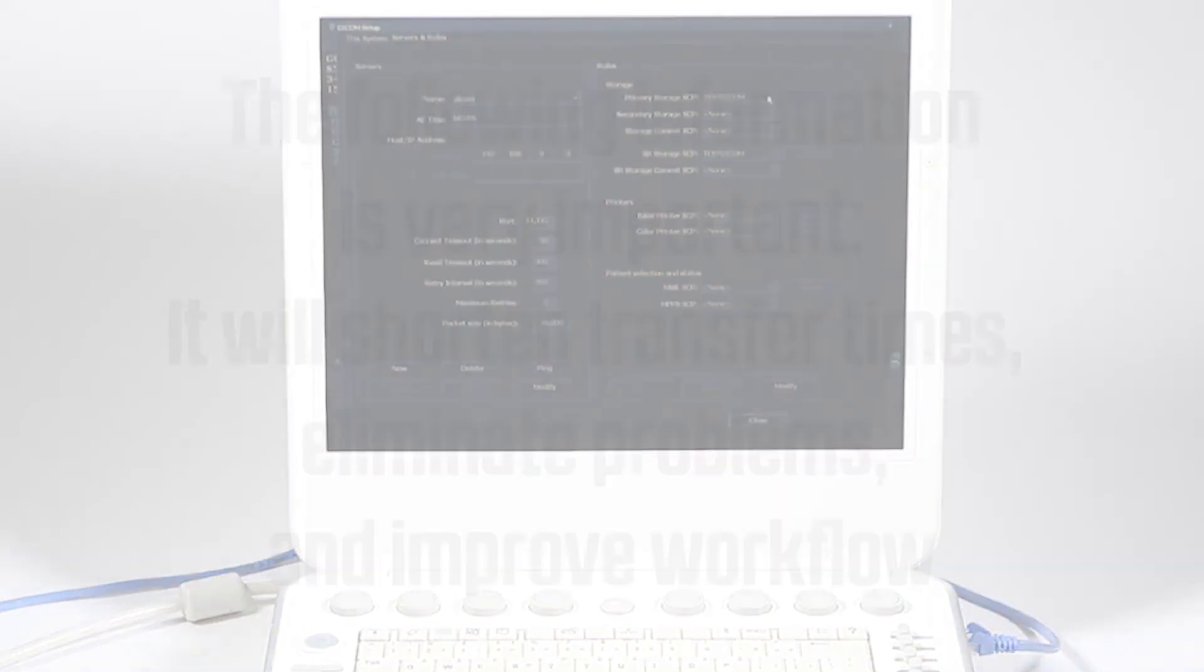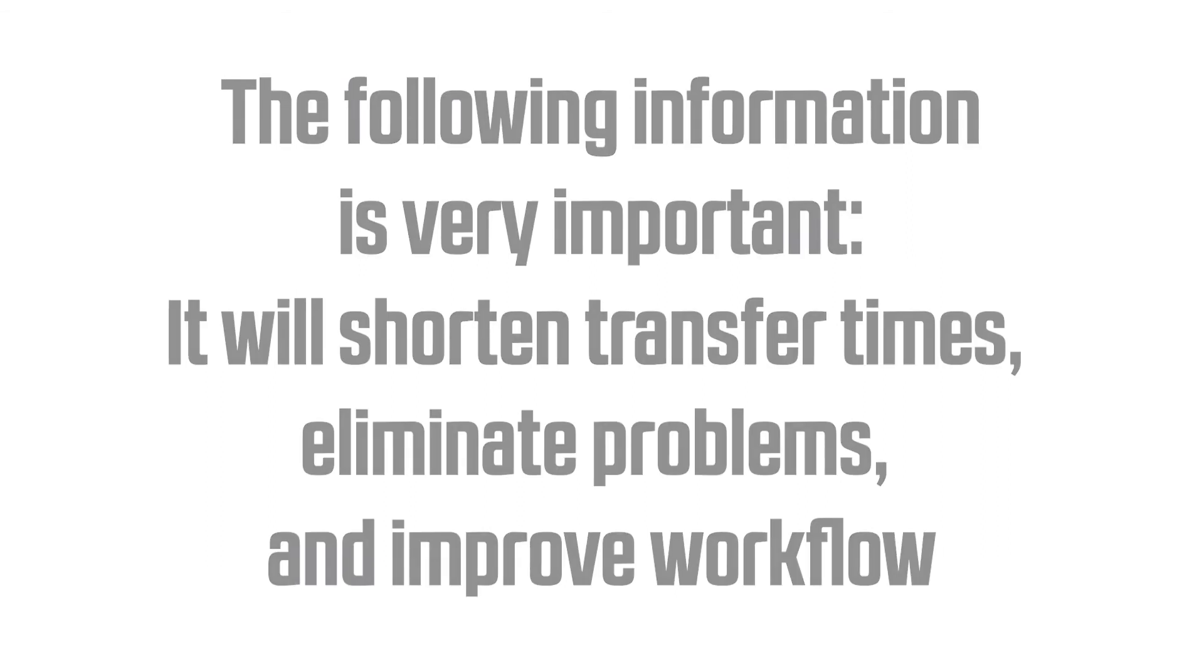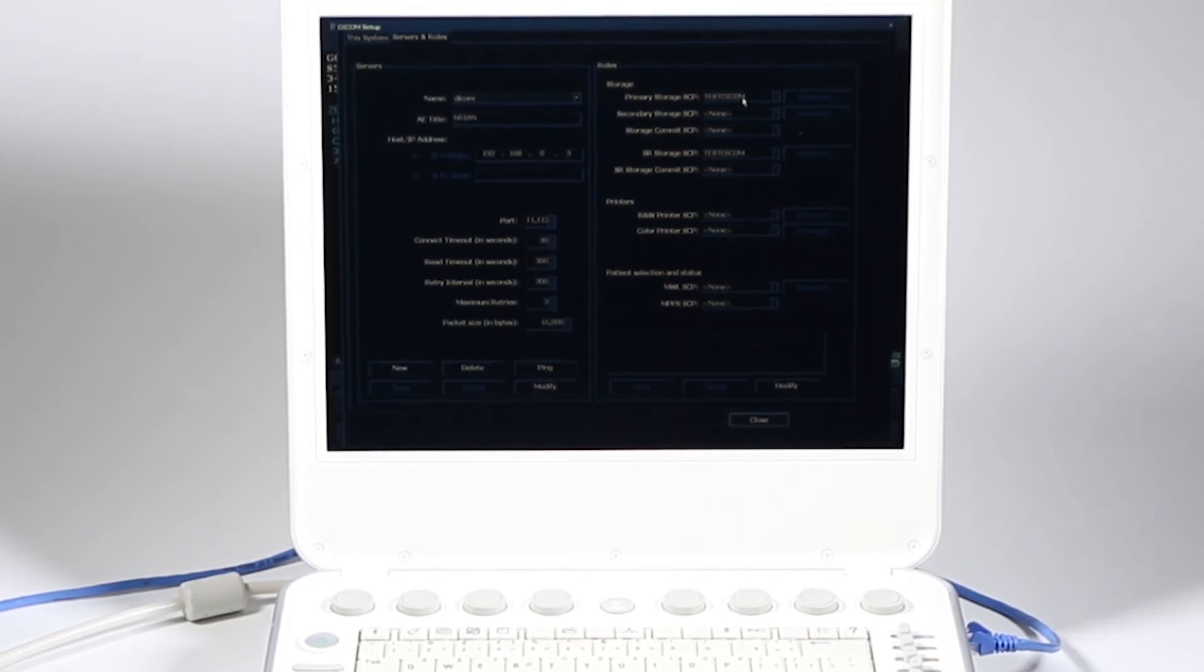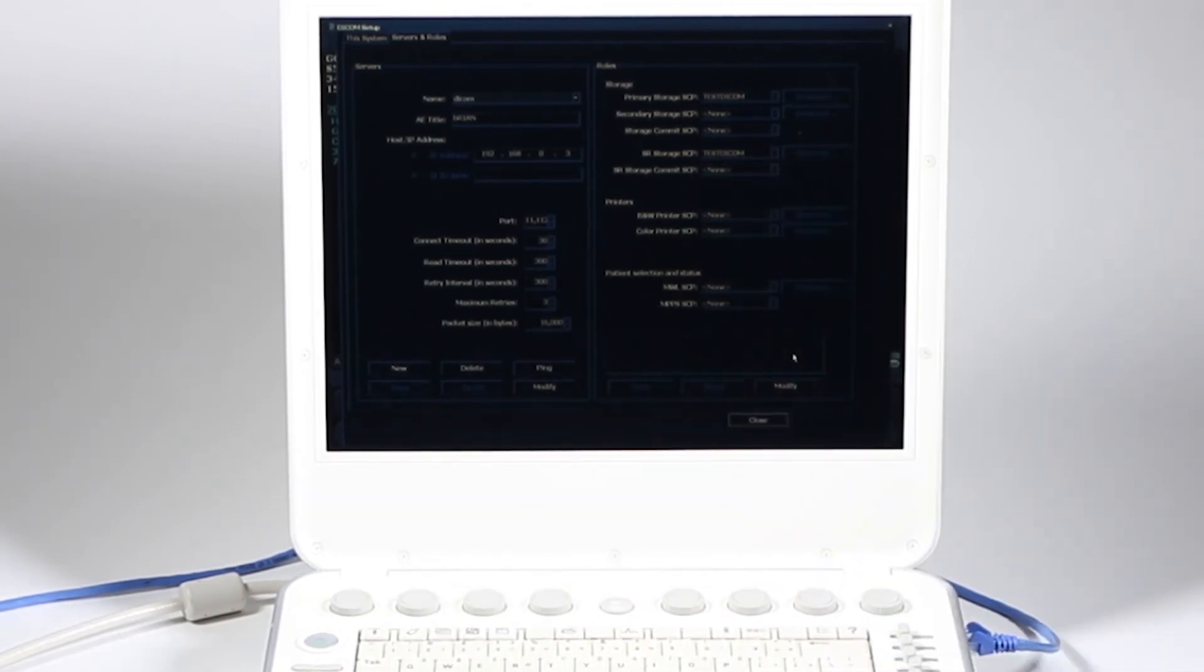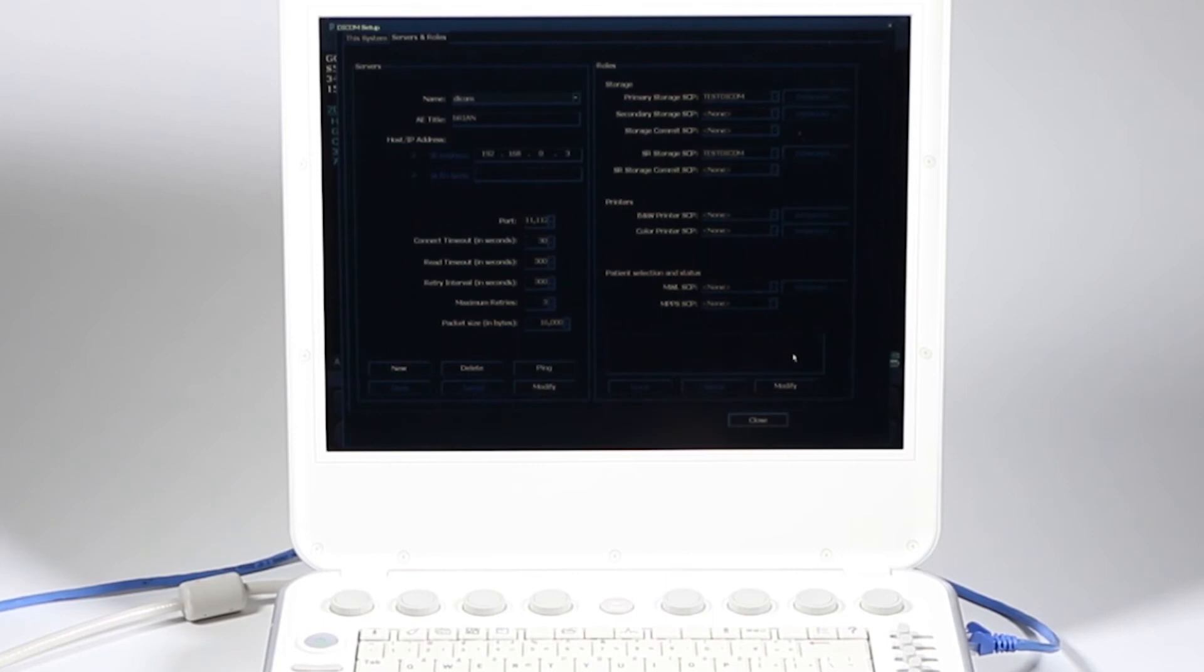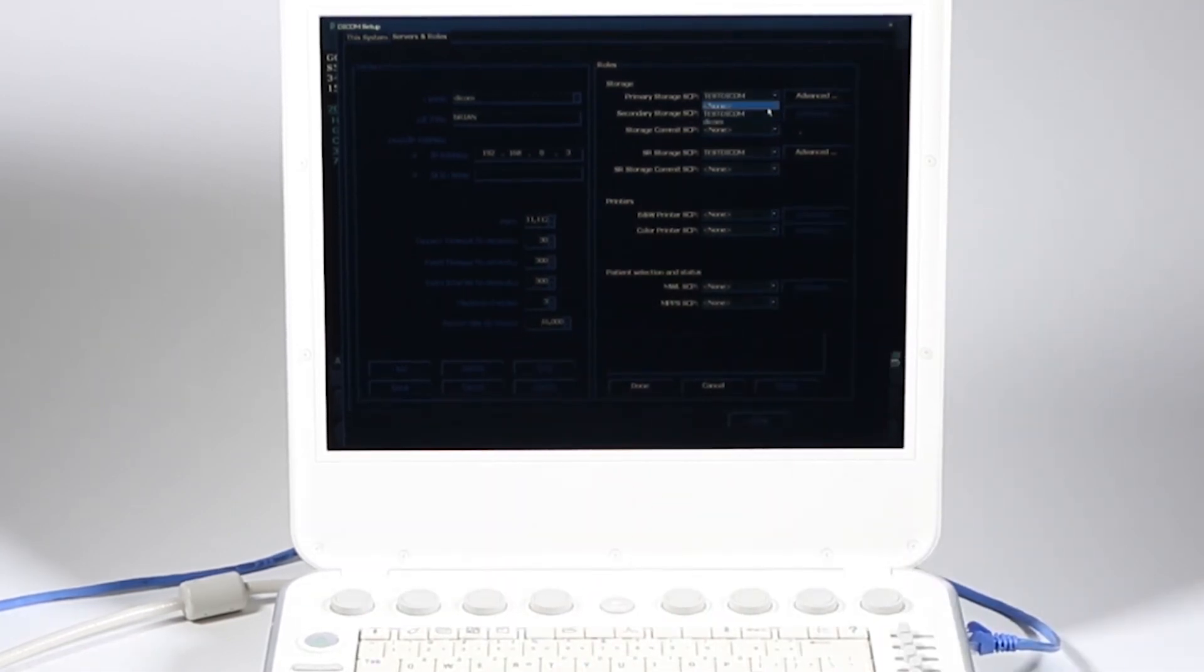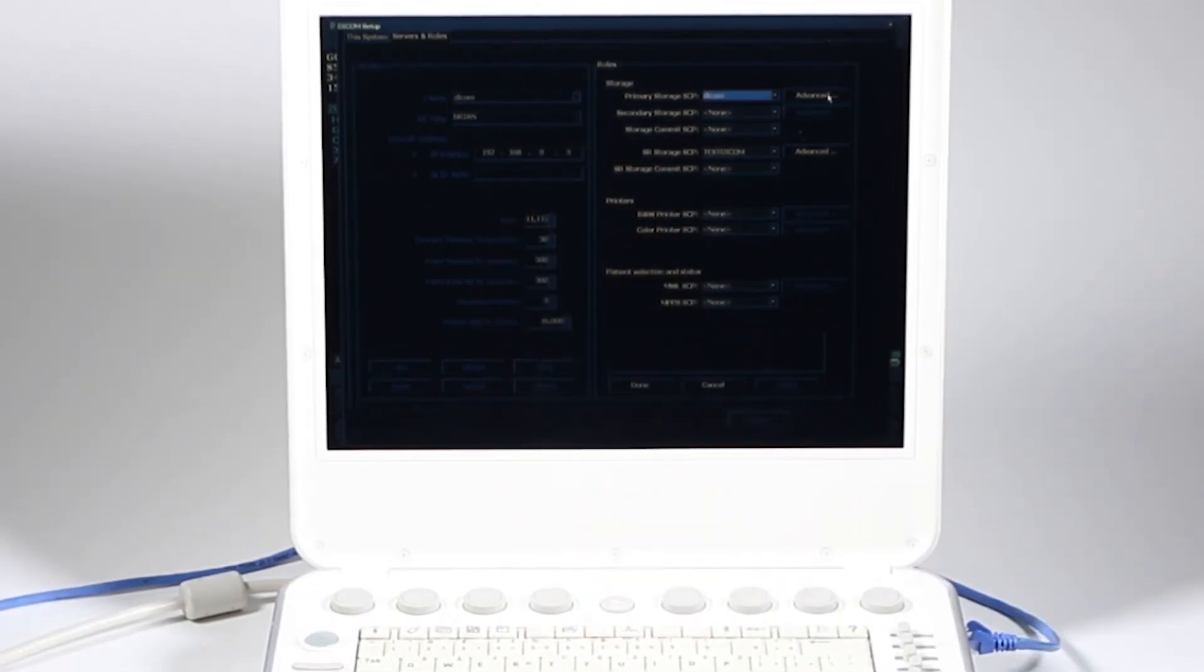I can go ahead and come over here and I want to select my roles. This is also very important. I want to go down here and click modify. Right now, the roles are set to send to that other DICOM test server that I did. What these roles mean when I export my images, it's saying, where do you want your images to go? Do you want to send structure reports? Do you have secondary servers? I'm going to go ahead and click modify.